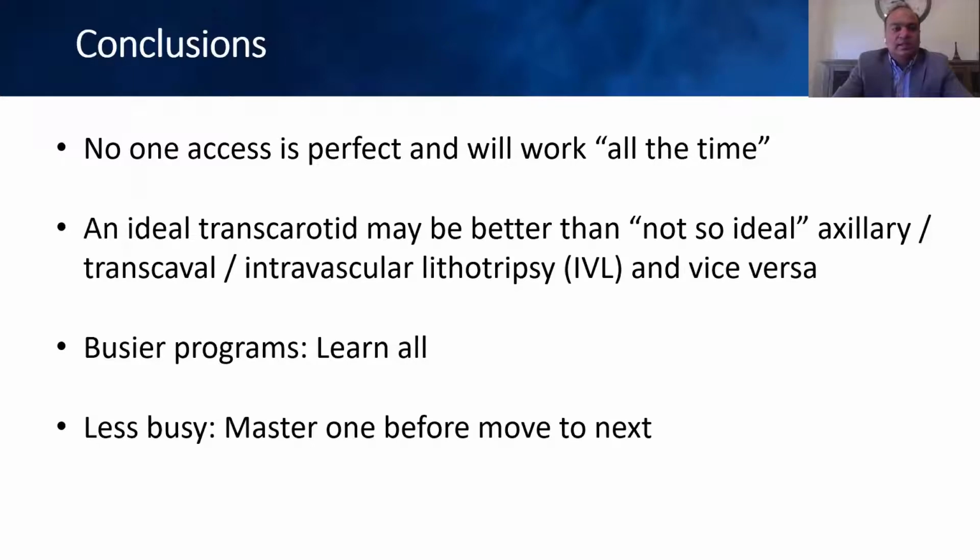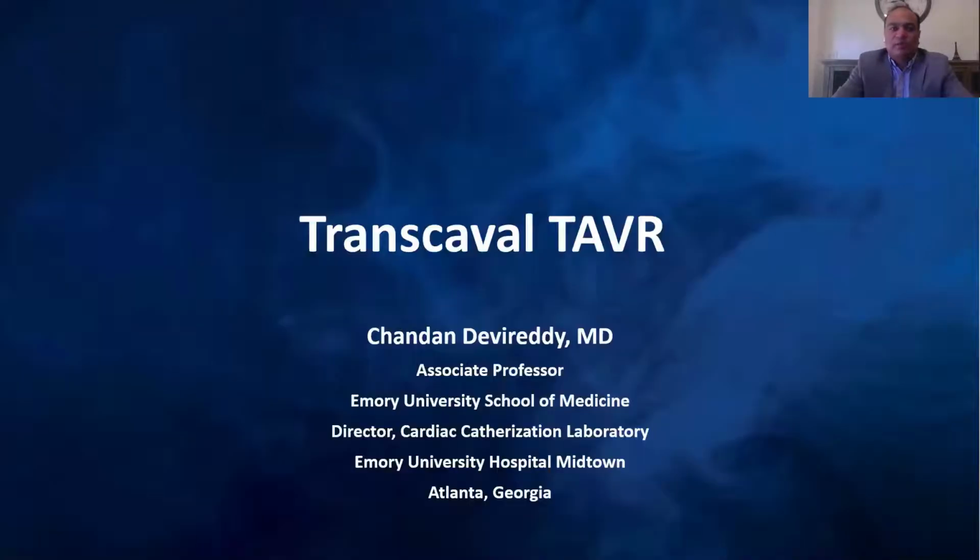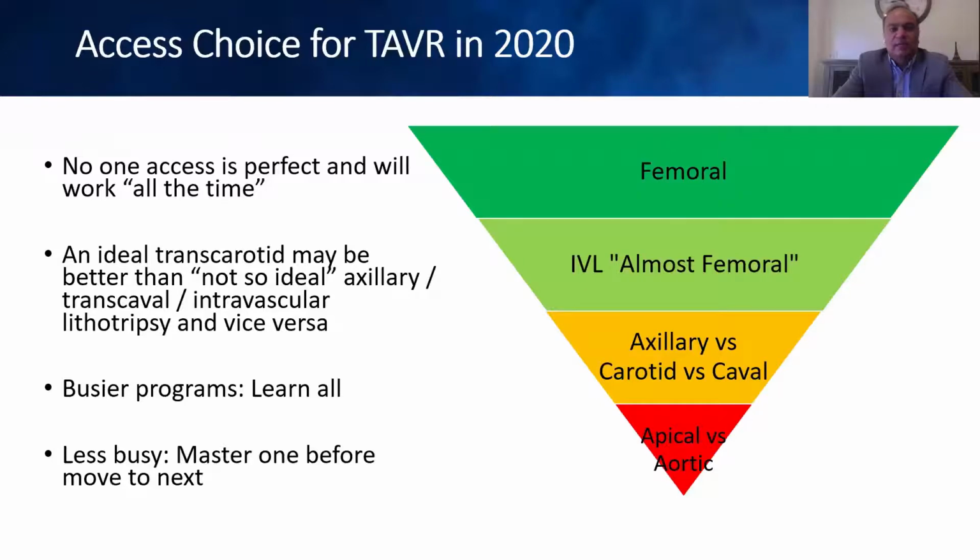So in conclusion, no one access is perfect and will work all the time. An ideal transcarotid may be better than a not so ideal axillary, transcaval, or lithotripsy, and this comment is true vice versa also. Sometimes transcaval may be better than a not so ideal axillary and vice versa. So if you're a very busy program, maybe you need to learn all of these, but if you're less busy, then maybe master one before moving to the next.